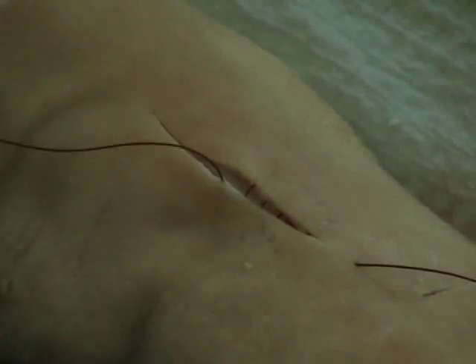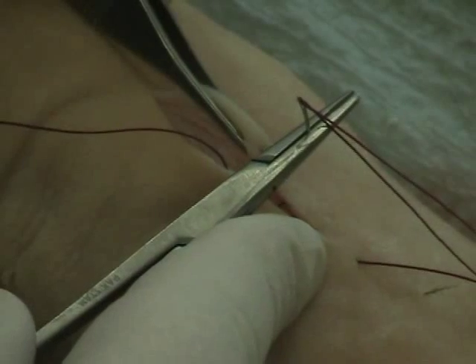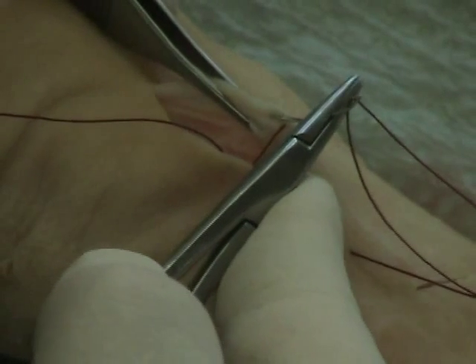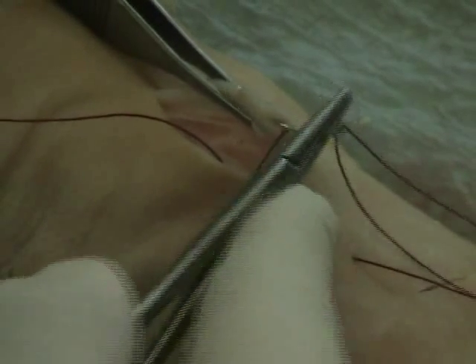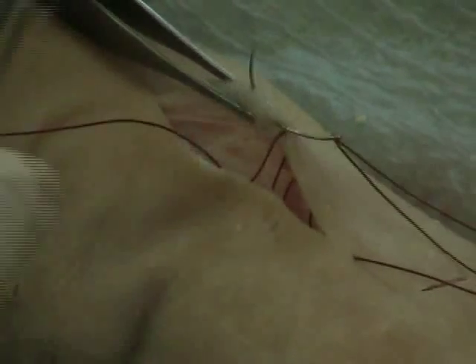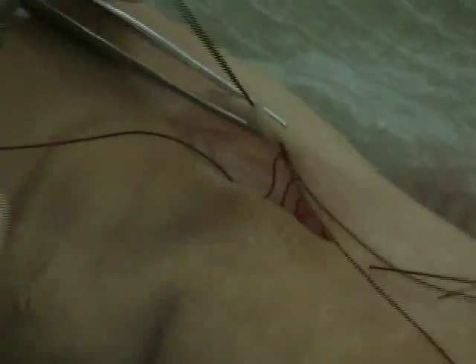See the pattern that's being developed. I pull across to see where I am, pick the skin up on the other side, go in the dermis, advance, and pop out the other side. While I'm flexing the needle in this direction, I'm pushing it forward at the same time. Doing those in combination decreases the risk of bending the needle.